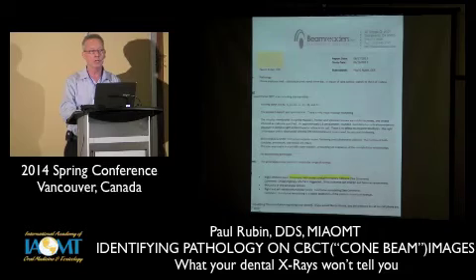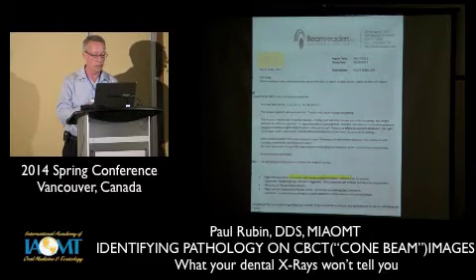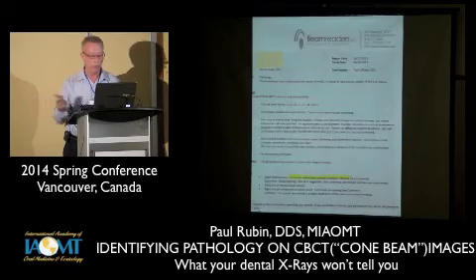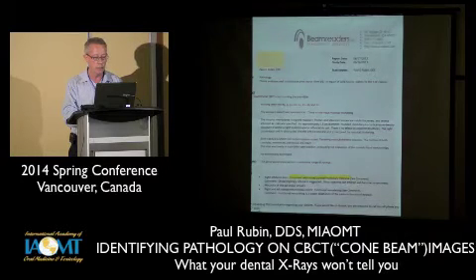But certainly if you have a question, if you don't know what's going on, you want to be able to inform the patient. So it's a little hard to read here, but down at the bottom here, what they came up with on the right ethmoid sinus, consistent with mixed cortical medullary osteoma. And their comment was that otolaryngology referral is suggested. Sinus osteomas can enlarge and become symptomatic.